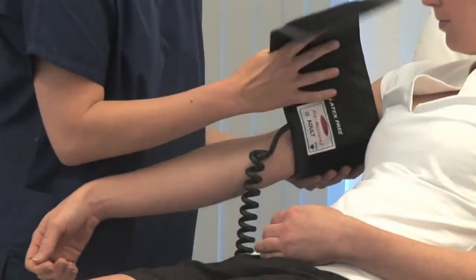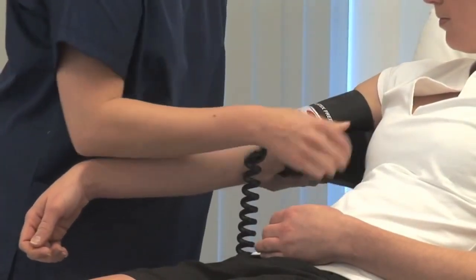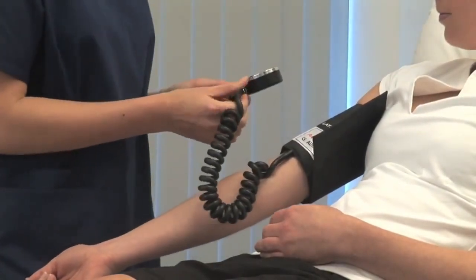Choose a cuff of appropriate size and place the centre of the bladder over the brachial artery. Normally the right and left arm will give a similar result. Measuring over thin clothing should not affect the reading.